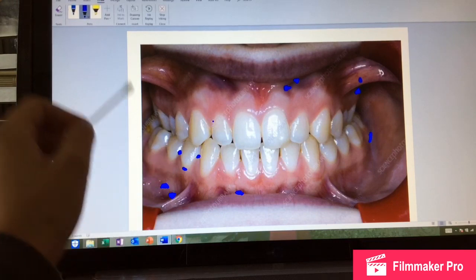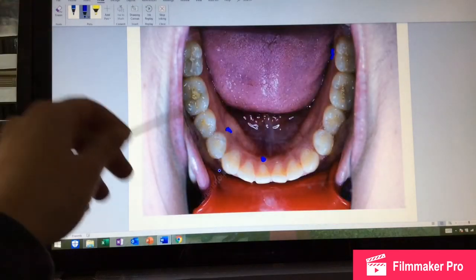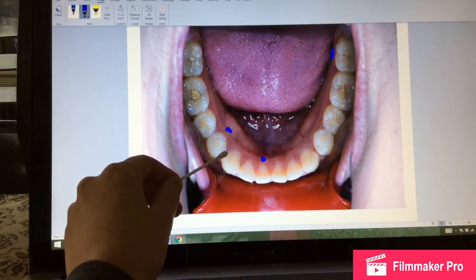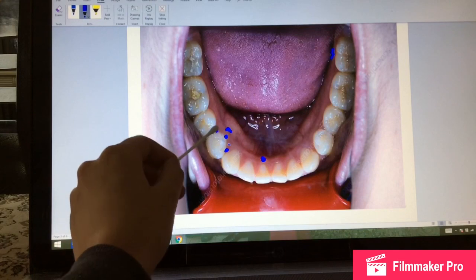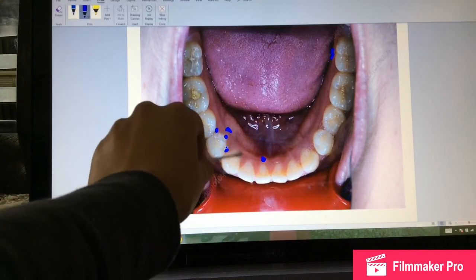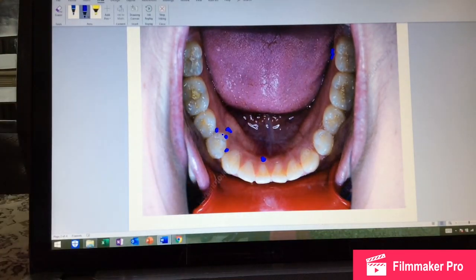And then the lingual side, you would go down, and then in the same tooth, in the same area, like this. So there are 6 in total, 3 on each side. And it is around the neck of the tooth, at the gum line, injecting straight down.